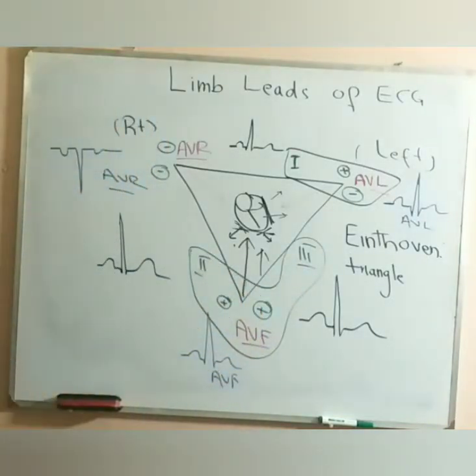And as you get along in the understanding of the ECG, there will come a time when you will be familiar with the importance of the AVR in actually pointing out ischemic changes on the right side of the heart and the posterior wall. But that takes some time. Though in the limb leads, out of the 6, lead 1 and AVL represent the lateral wall, 2, 3 and AVF represent the inferior wall. AVR, at this point in time, when you are about to understand the basics of ECG, better make a concept that AVR doesn't contribute in knowing the ischemic changes or electrical activity.